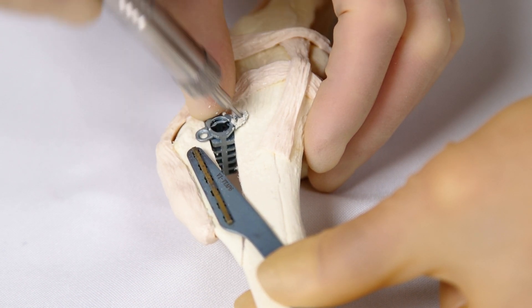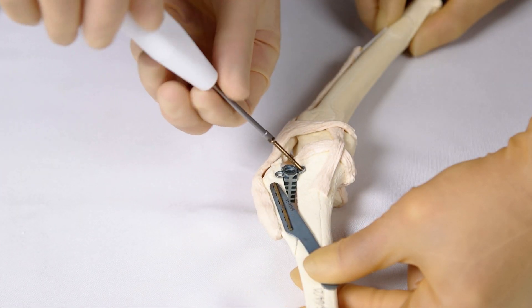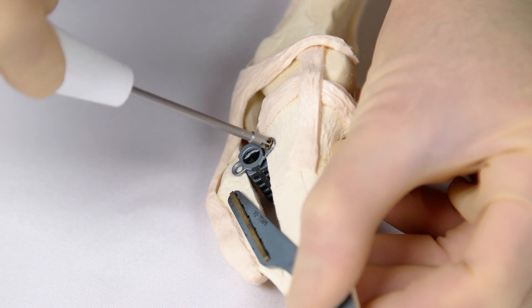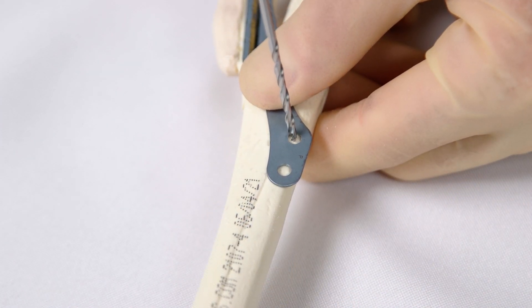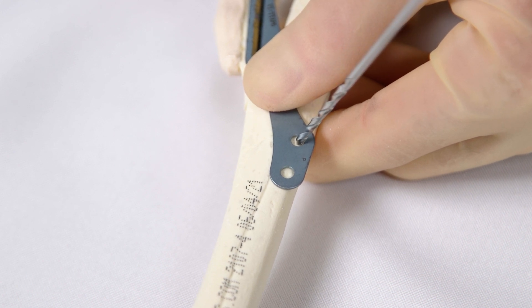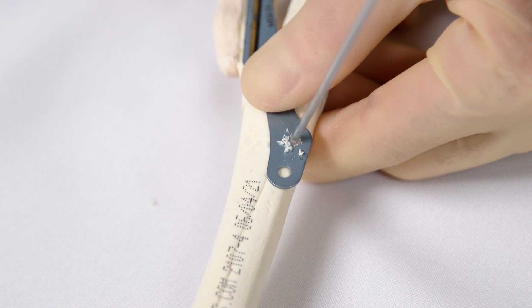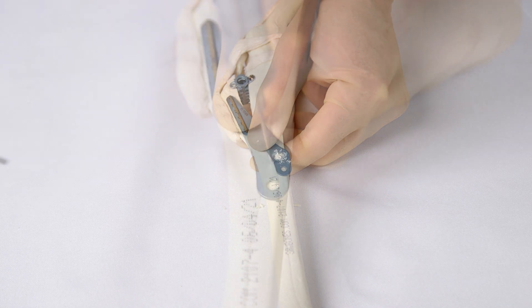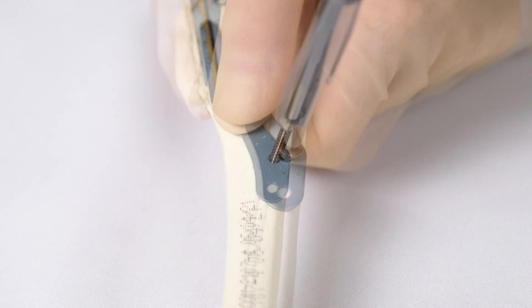Measure the depth of the pilot hole and place a 2.4 millimetre titanium screw of the appropriate length. Ensure that the head of the screw engages the cage ear correctly. Now drill either of the two distal plate holes in the tibial diaphysis; either 2.7 millimetre or 3.5 millimetre screws may be used here. Be aware of the edge of the tibial cortex — drill straight to avoid the cortex. Measure the depth and place the screw, ensuring good engagement of the plate hole with the screw head.